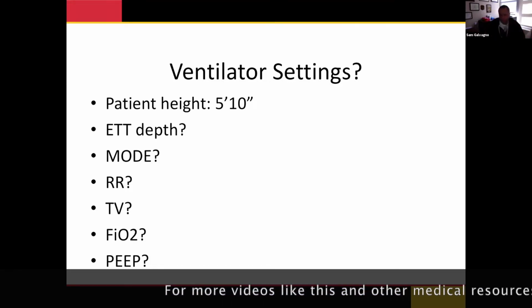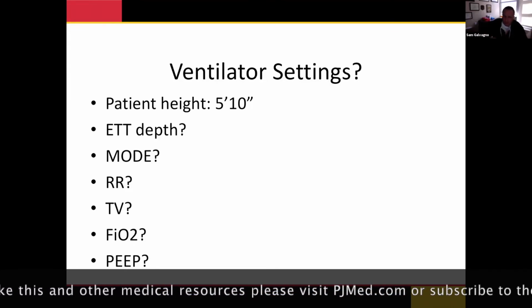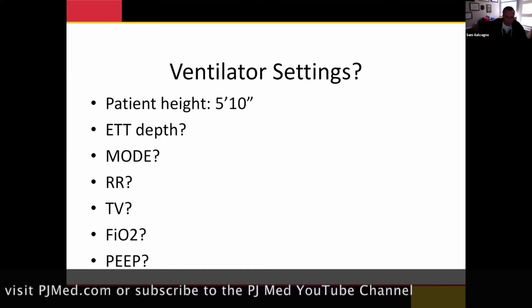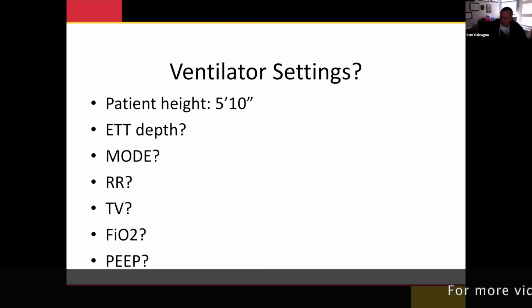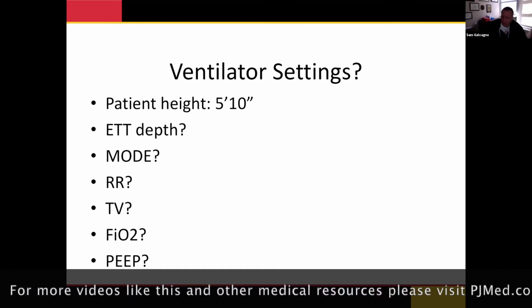We'll show this again in a minute. We don't want to jump right to that high PEEP necessarily until we titrate it up because we need it. So try to work your FiO2 down. Start at a PEEP of 5 or 10. You can add in maybe 10 if this was an obese patient. I'm trying to remember, this guy wasn't terribly obese actually, so I would say weight was somewhere in the maybe 80 kilogram, high 80s kilogram range.